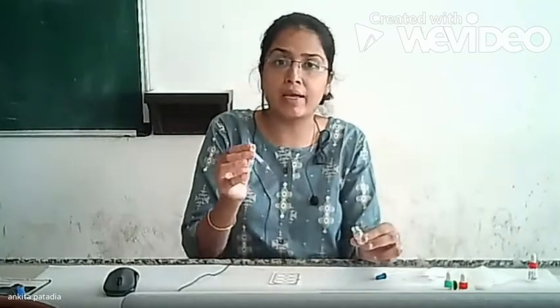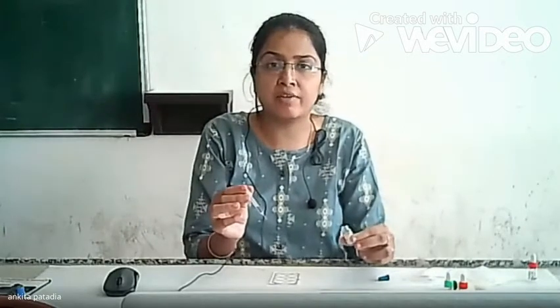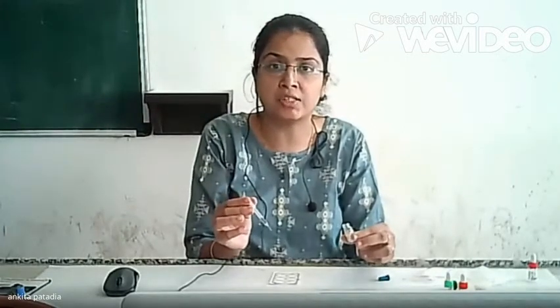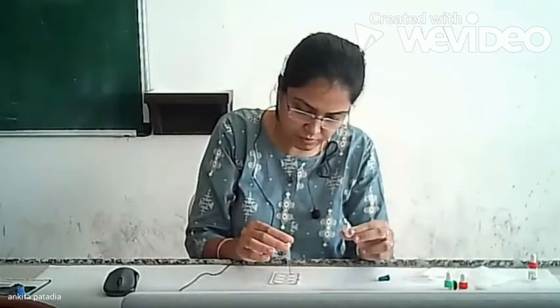Now when you are adding the antigen, as I said, you have to add it with the distance. Don't allow the tip of the dropper to touch the sample. Like this.